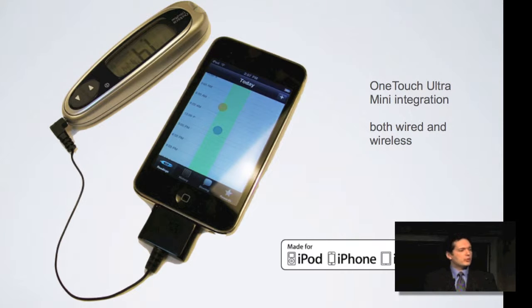Now, version 2 is far more advanced. It has the teachable moments component to it. It has the connectivity directly with the device, because we did not want self-reported data with these adolescents, because we had a feeling they might try to game the system, right? So the data can only be entered through the meter. And perhaps some of them could game the system by getting their friends to take their measurements for them, but that must be a really good friend, right? And it's probably not sustainable.